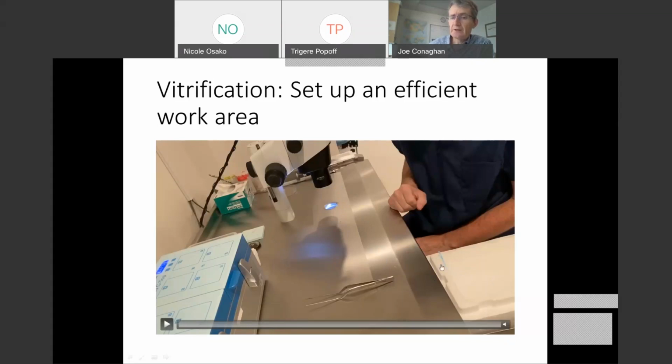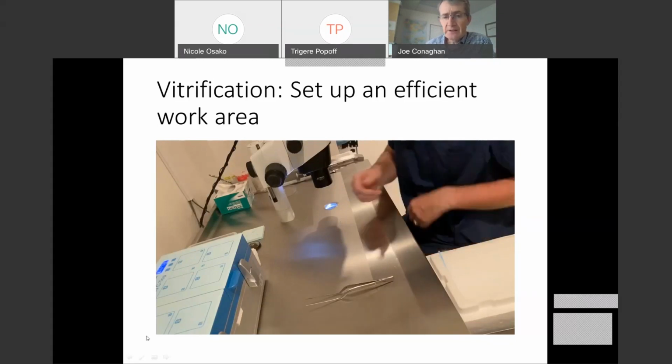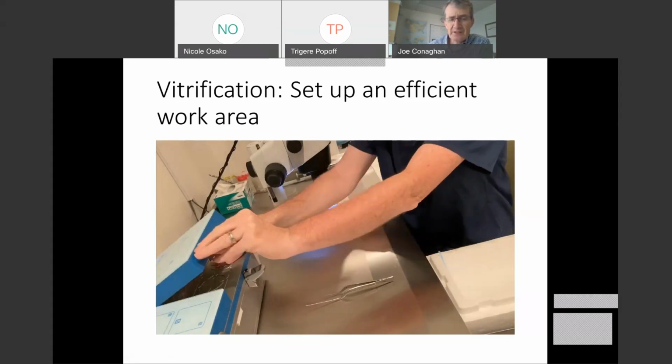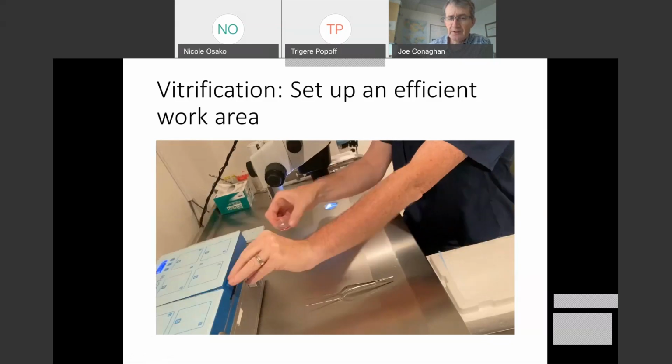So I have a cryolock right here that I'm going to warm. Right? It's sitting in the liquid nitrogen bath and it's ready to go. In here, I have a dish of warm thaw solution, and that's been warming in the incubator for at least an hour. So I know that that's at 37 degrees. And then I have my microscope here with my warm stage. So I'm ready to do my warming event. Now, hopefully this video will come across on the webinar this morning. Sometimes these videos can be a little stuttery or they can be a little glitchy.